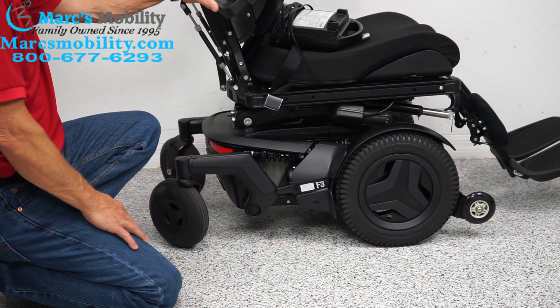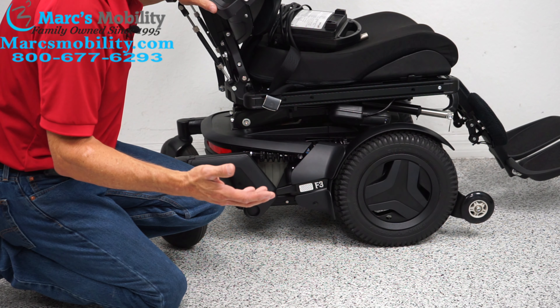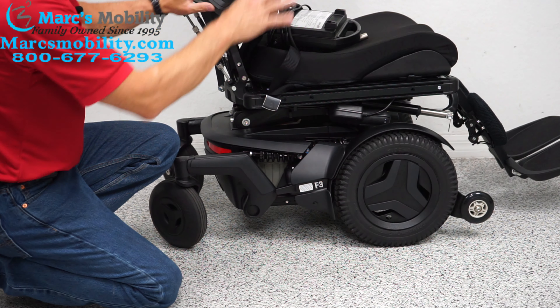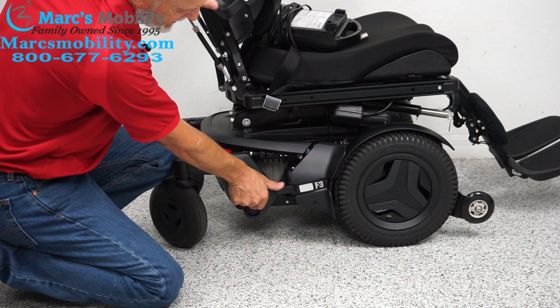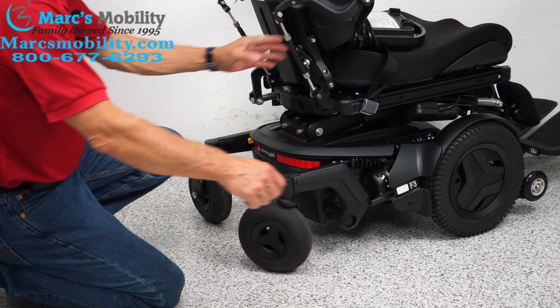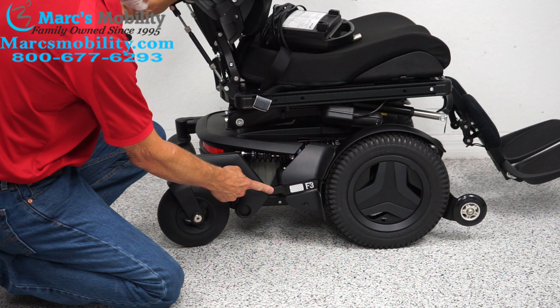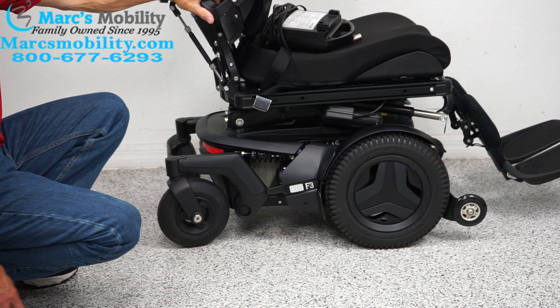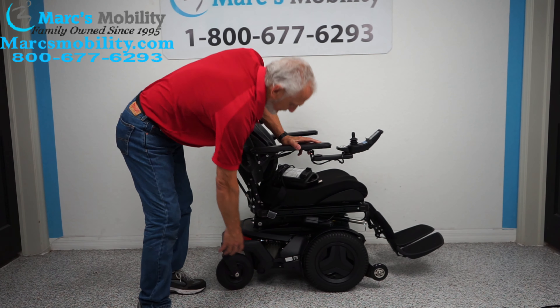If you need to push this chair — say you forgot to charge it — you would turn the power off first so there's no resistance in the motor. Then you see this little handle here? Push it down. You have to do both motors on both sides, and then you can wheel the chair wherever you want. When you're done, put it back up — make sure you put it back in gear. Once you charge your chair, you want that handle back up right away.